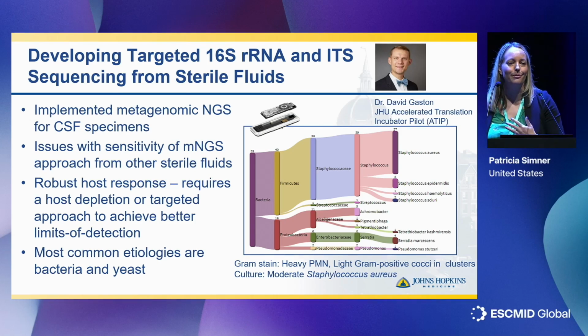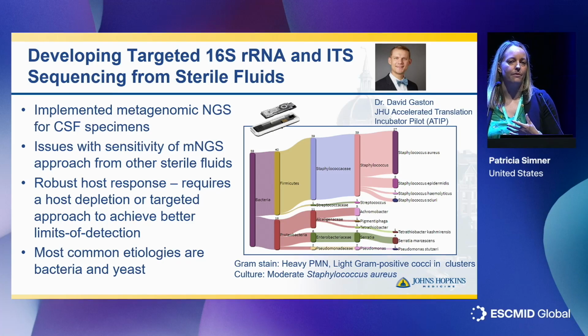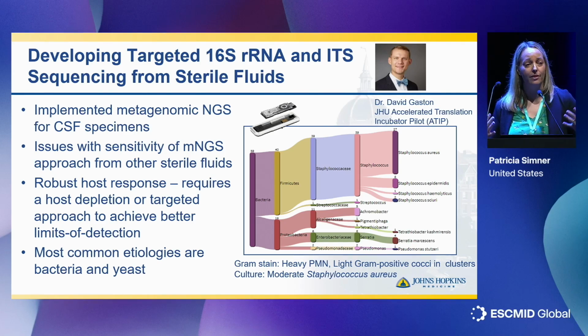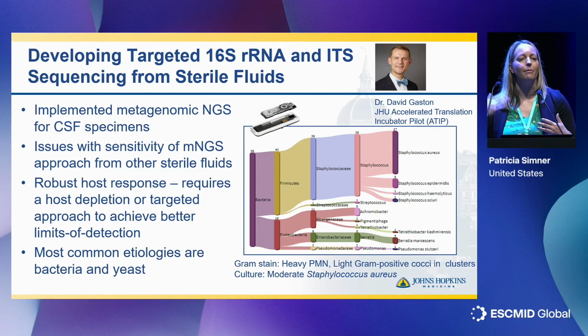go live with other fluids. But unfortunately, the method that we had optimized and developed for CSF just wasn't meeting the performance characteristics that we wanted from other sterile fluids. Mostly we see a robust host response in these sample types, and it was interfering with our limits of detection, or analytical sensitivity.